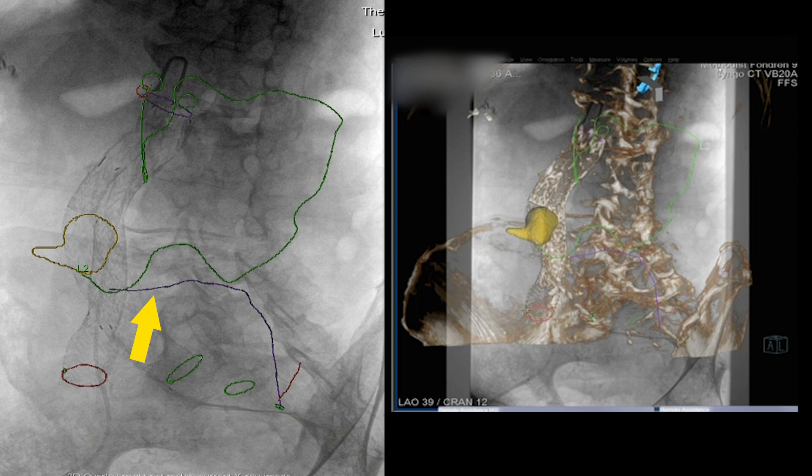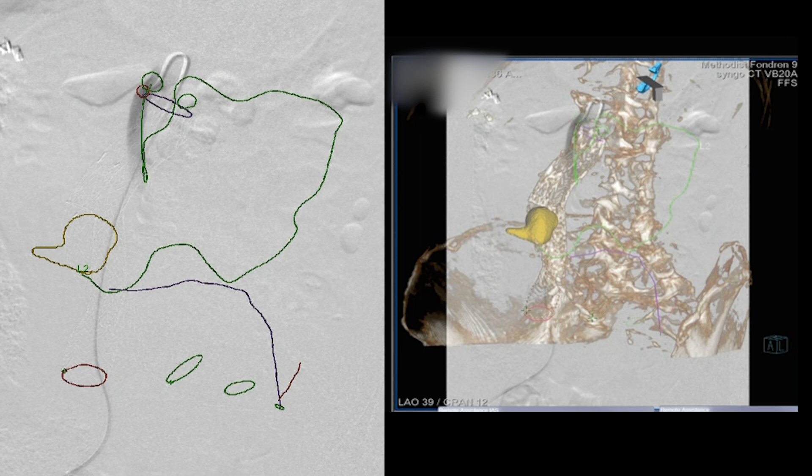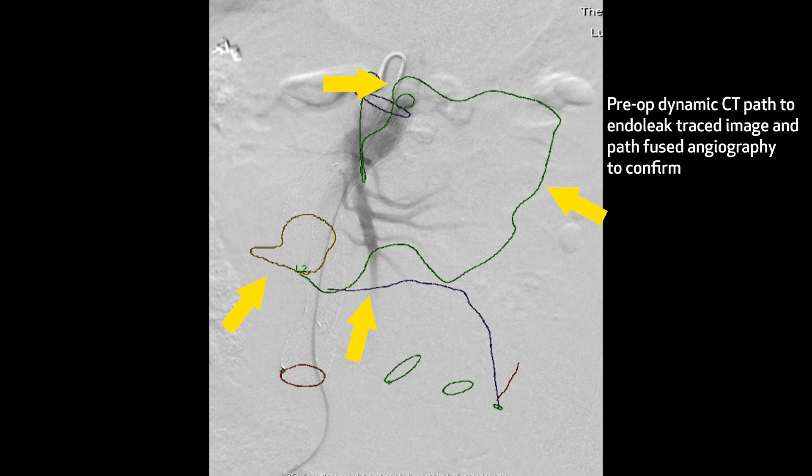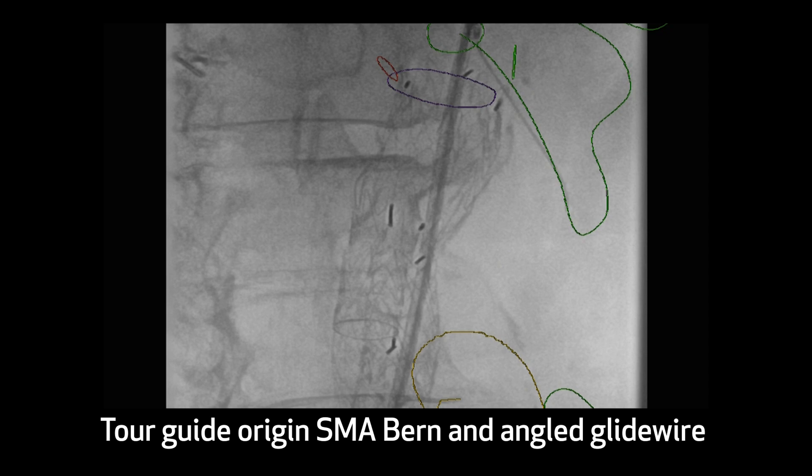That last arrow points out the first branch of the IMA. When you embolize, you don't want to occlude the sigmoid branches. Here's the angiogram — it's just confirming. There's a reverse curve catheter in the SMA, and it demonstrates the approach through the middle colic artery, through the marginal artery, and back into that aneurysm cavity.